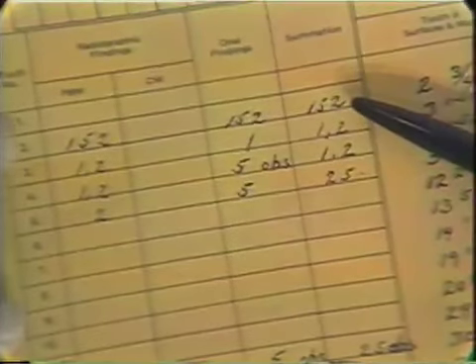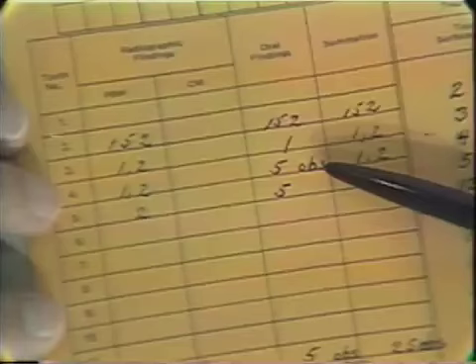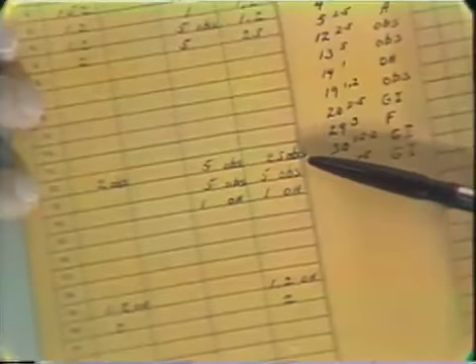as to surfaces involved. For number 2, it will be a 152. For number 4, it will be a 152. The occlusal was observed, but because we have a mesial and distal cavity, we must include the occlusal and make an MOD restoration. Here for number 12, the entire surfaces, number 2 and 5, will be observed.